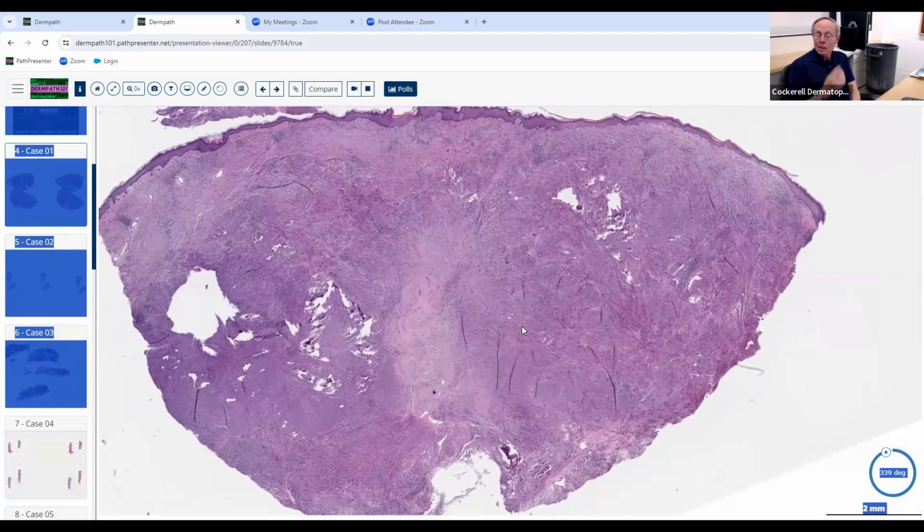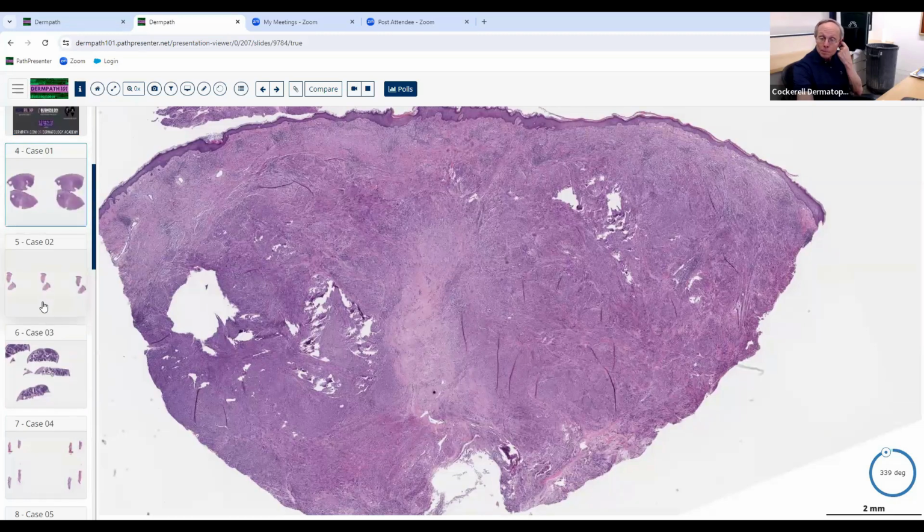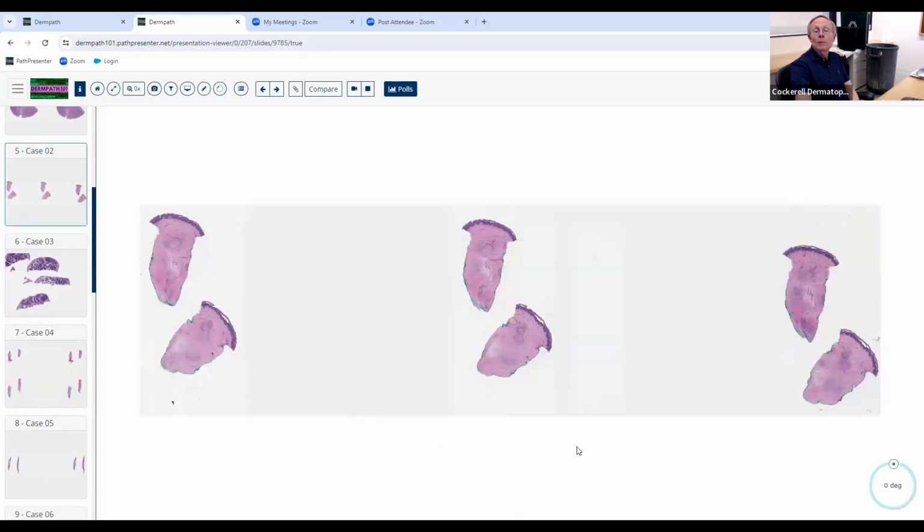If you're going to stain this, obviously smooth muscle actin; desmin can also be used. We usually just use smooth muscle actin. You don't really need both. If you're staining for fibrohistiocytic differentiation, factor XIIIa, that's classically seen in dermatofibroma, for example. CD68 stains histiocytes. And then for neural, obviously SOX10 and S100 protein are the major stains that we use. So leiomyosarcoma, and if you get one on the exam, it's probably going to be something like that.